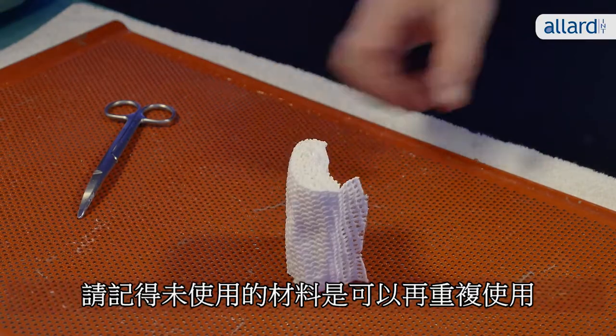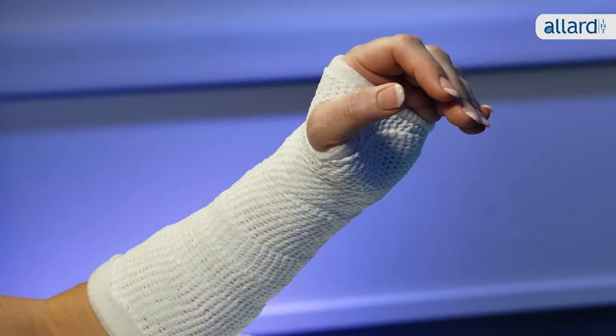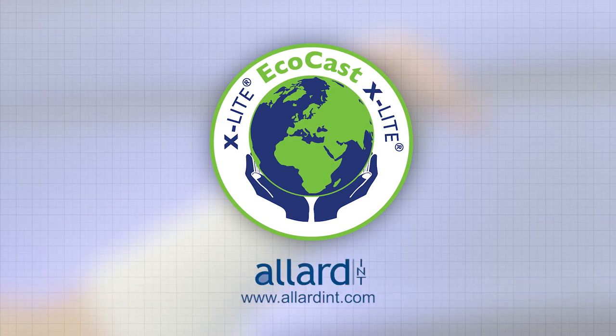And remember, you can always reuse material not used. EcoCast — environmentally friendly and easy to use. For more information please visit allardint.com EcoCast.